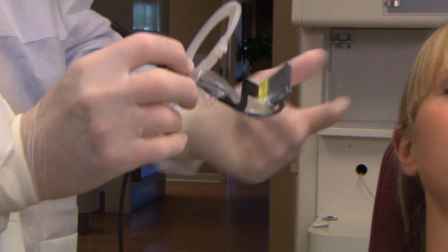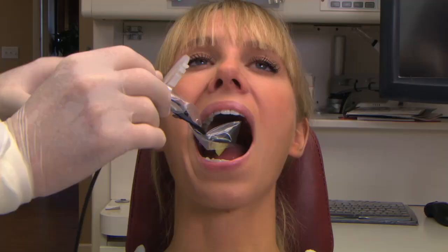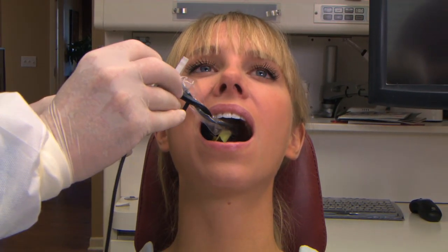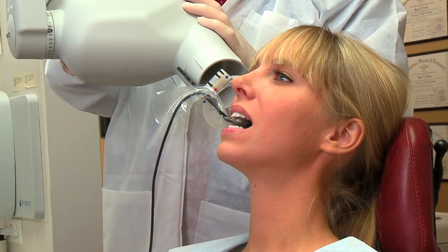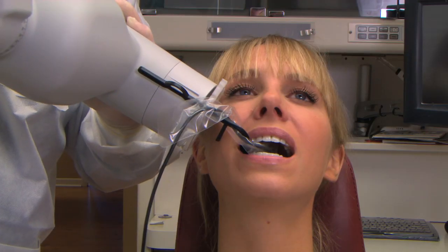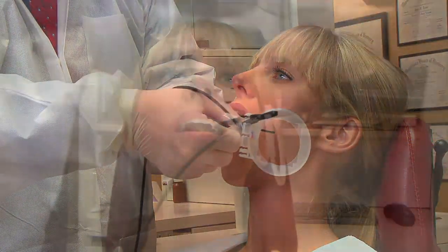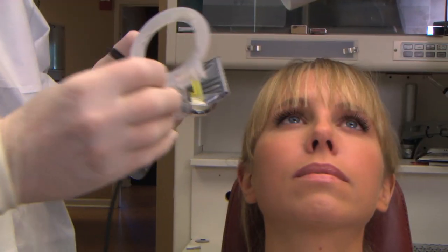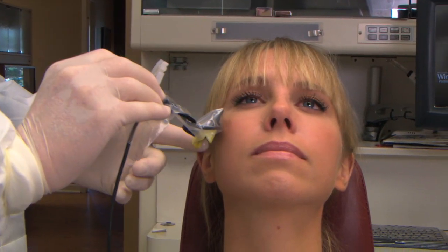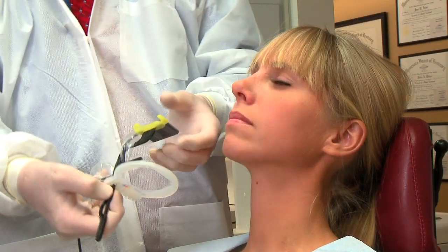Go in on a 45-degree angle into the lingual side of the tongue. Place the sensor, turn, and push to the midline. Tell the patient to close gently. Position the cone up against the aiming ring and take the X-ray. For the opposite lower left, position the cone and take your X-ray. With this setup, you get the upper right, 1, 2, and the lower left, 3, 4.